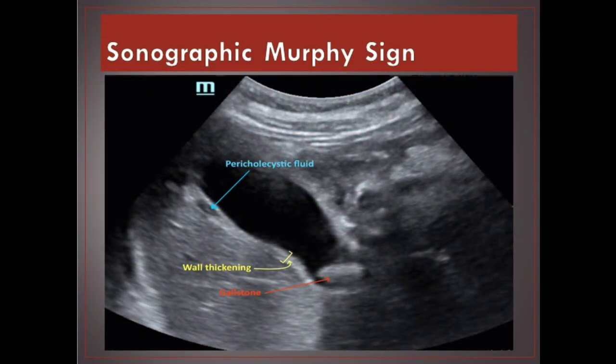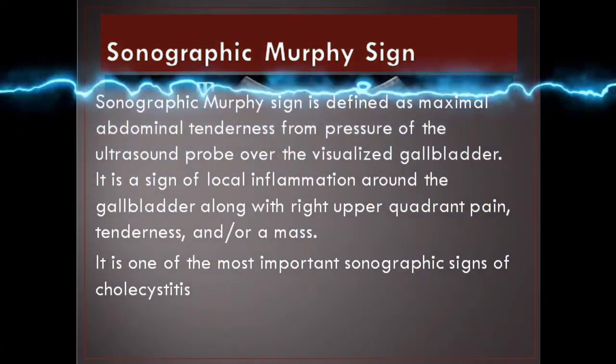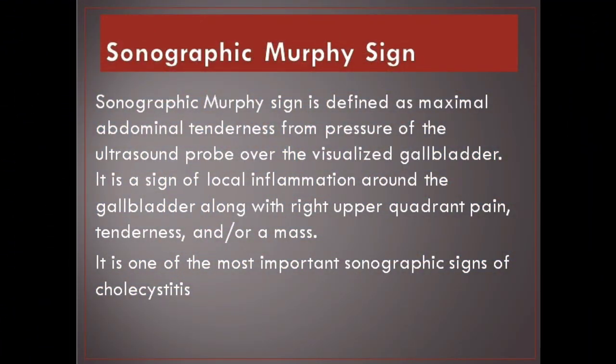Sonographic Murphy Sign. The sonographic Murphy Sign is defined as maximal abdominal tenderness from pressure of the ultrasound probe over the visualized gallbladder. It is a sign of local inflammation around the gallbladder along with right upper quadrant pain, tenderness, and/or a mass. It is one of the most important sonographic signs of cholecystitis.